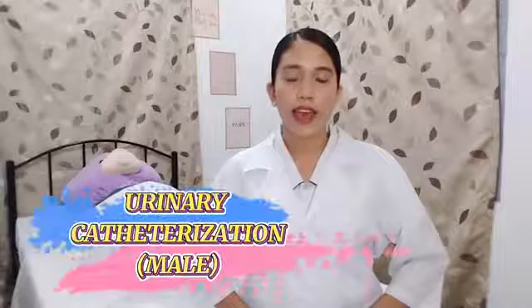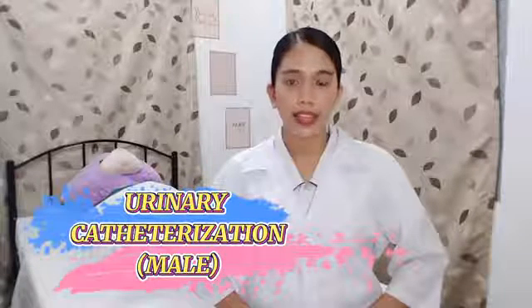My name is Gwyneth Marietta T. Cabilino, a second-year BS in Nursing student from the University of Mindanao. Today, I will perform the urinary catheterization for a male client. It is the introduction of a urinary catheter through the urethra into the bladder for installation or removal of fluids.